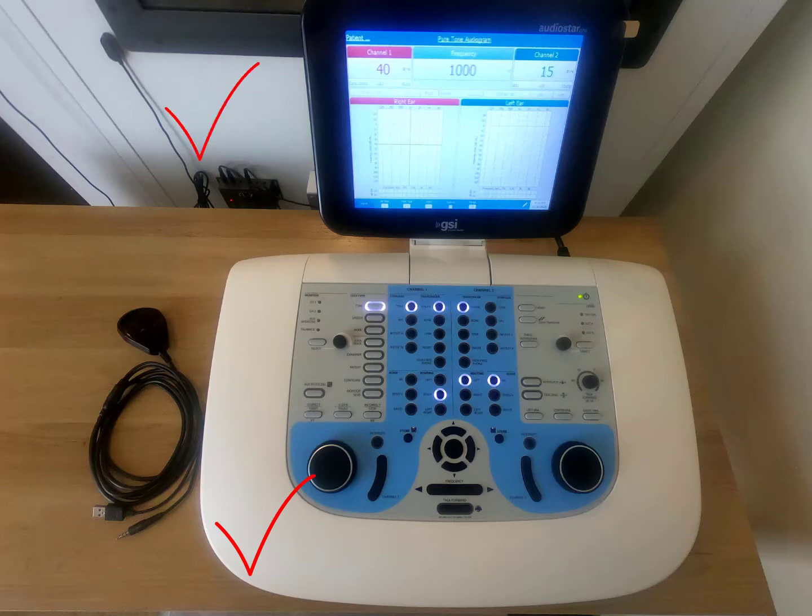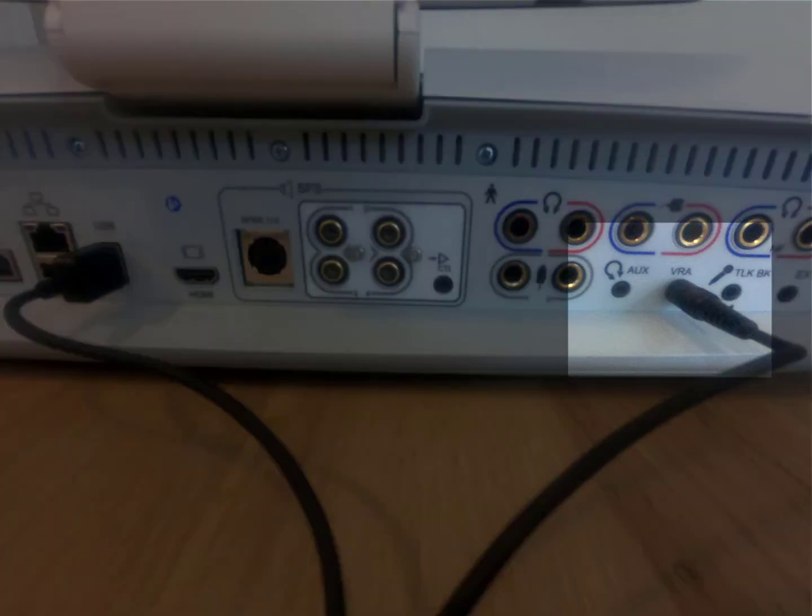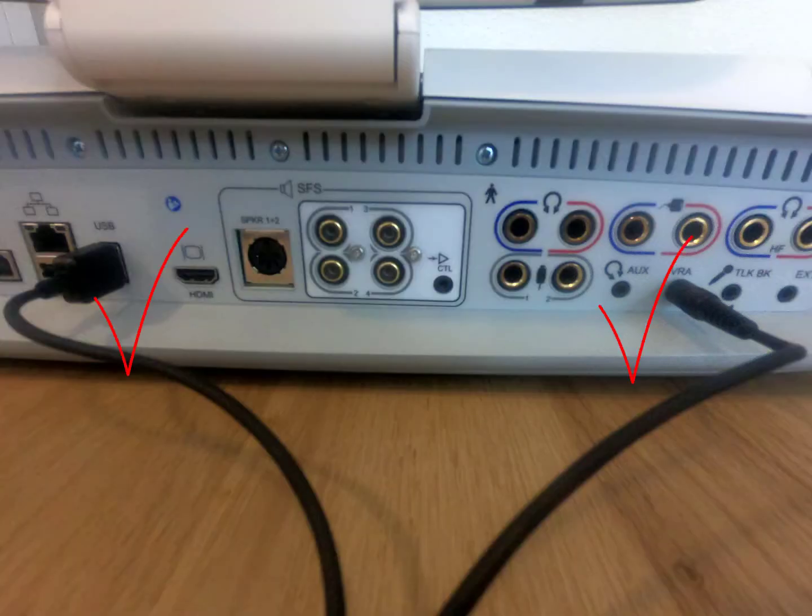Once we have all those, installation is fairly simple. We will turn the unit around to the back. On one end of the flex cable is a dual connector consisting of a USB cable and an eighth-inch jack input. The USB cable simply provides power and can be plugged into any USB port — the AudioStar has many ports so you can pick whichever you prefer. I like the one on the back since it's out of sight. The other input is for the actual VRA connection on the back of the AudioStar, which you can plug in as pictured here, and that's all we plug into the AudioStar itself.